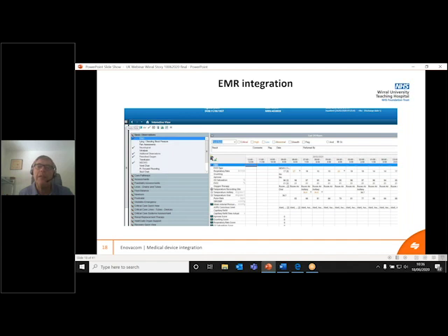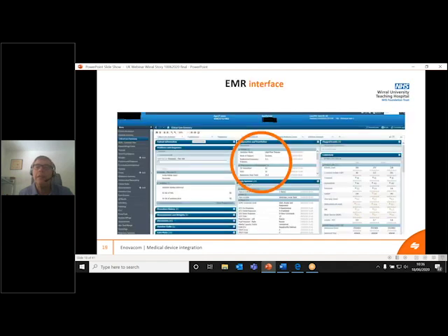Next slide, Mark. So you see here the M page is configurable by the user and it contains everything that you would need to review an intensive care patient, latest lab results, current respirator settings. You can open tabs to look at latest meds, micro reports, etc. So again, this is key to usability and success of integration.